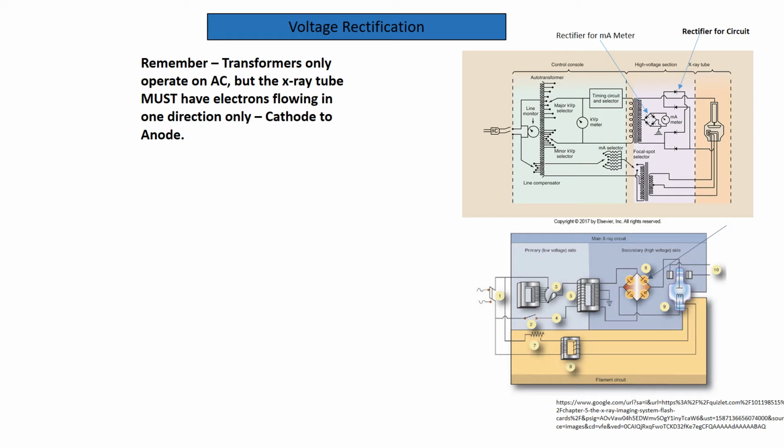The rectifier for the circuit in Bouchon's drawing are those four arrowheads that are almost in the shape of a little rectangle there. In the drawing for the circuit in Carlton, the rectifier is drawn in the diamond formation.